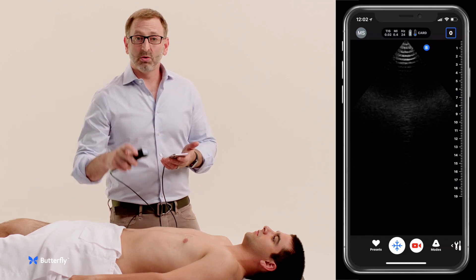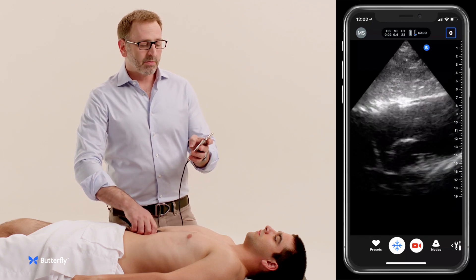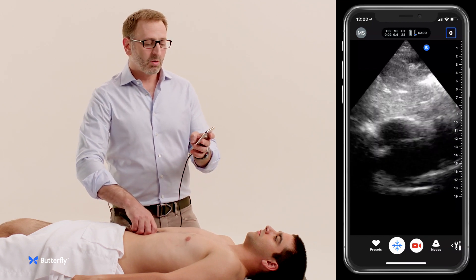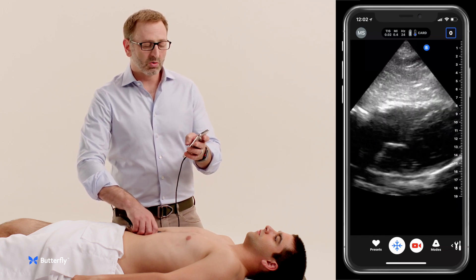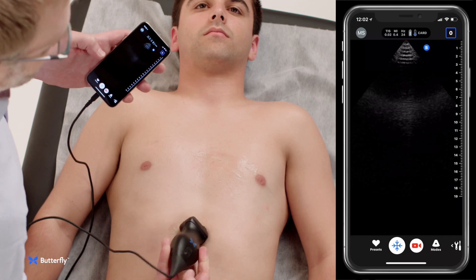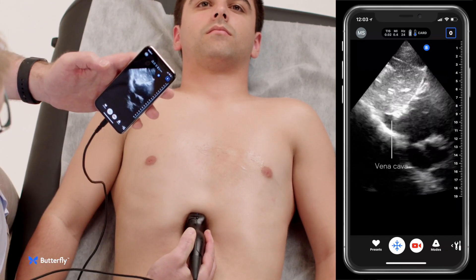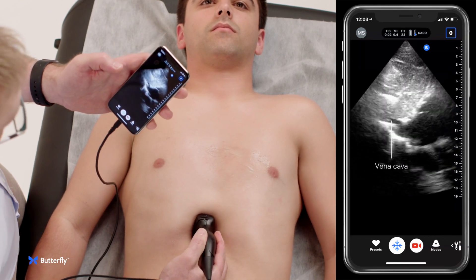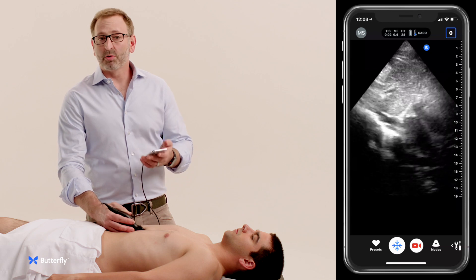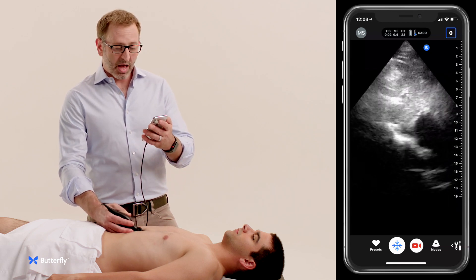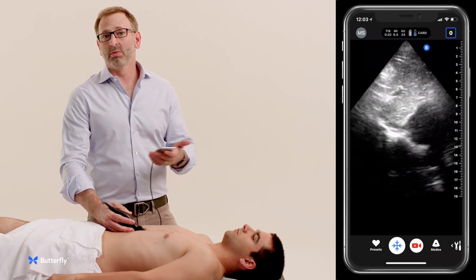We'll move on to a subcostal view with the indicator to the patient's left, just under the xiphoid process, looking for fluid surrounding the heart and any signs of LV or RV dysfunction. From this view, if we place the indicator towards the ceiling or patient's head, we're also able to get a look at the vena cava. In this case we can see it's flattening with respiration — no plethora or failure to collapse — which could otherwise indicate an obstructive cause of shock like pulmonary embolism or heart failure.